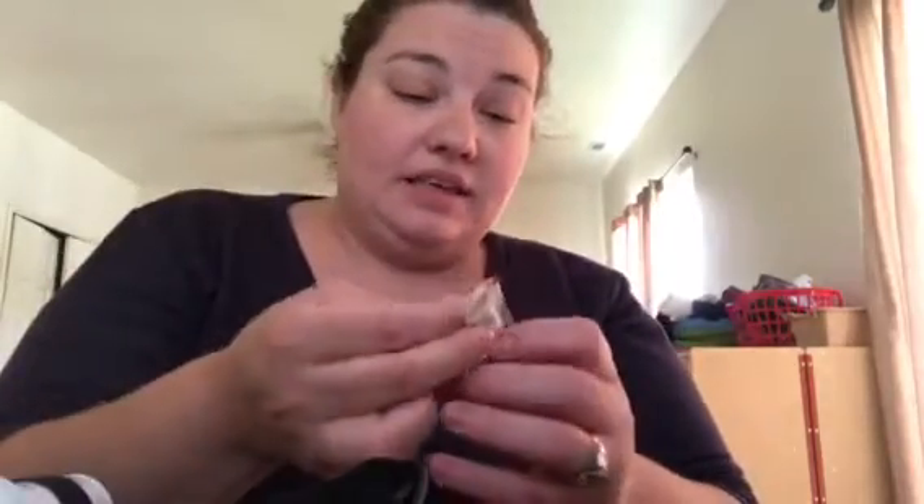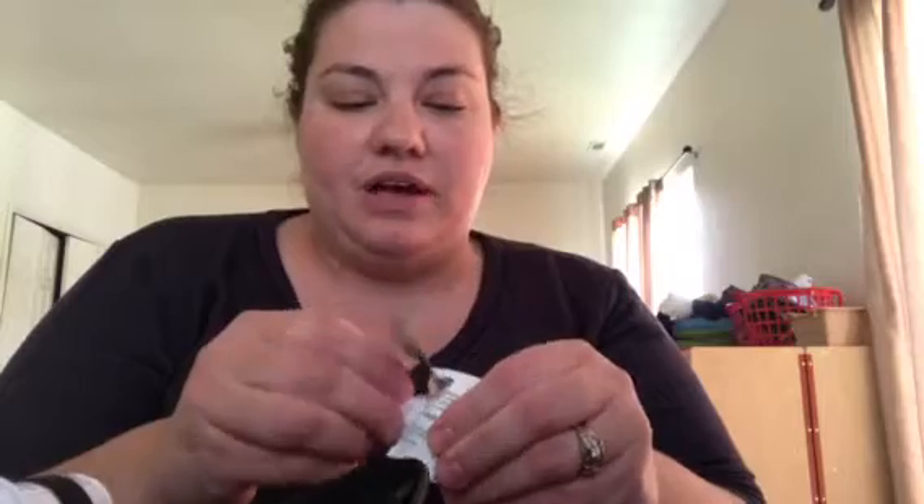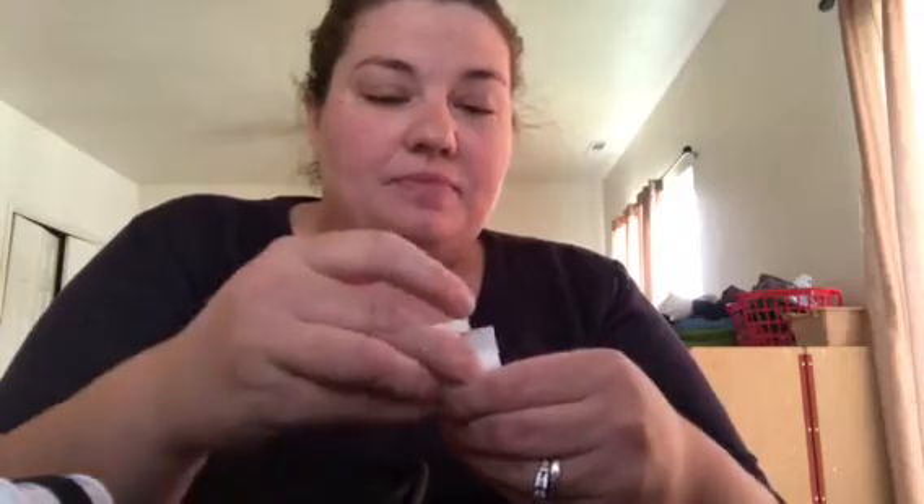Yesterday we didn't have anything under 150. It's just crazy — every day is so different, every day is all over the place right now. She's still not insulin dependent, because they said once she hits the 300 range, that's when she'll end up getting further treatment for it. Right now we're just simply testing.